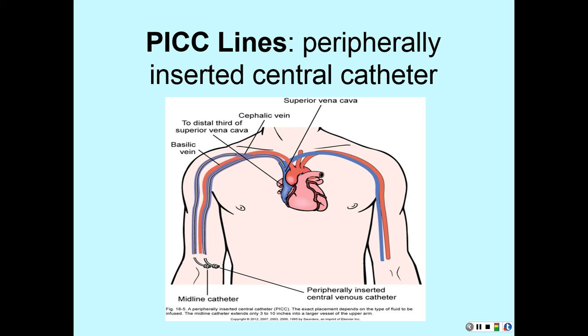So I immediately called down to the nurse in the x-ray department that put this in and said, hey, tell me about this PICC line. What was the length of it? Because I was at the bedside at that point. I didn't have time to go and look at the chart and all that business. So she said, we cut it. It was too long for the patient.